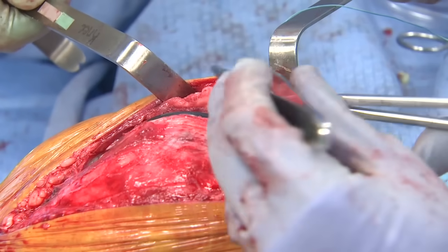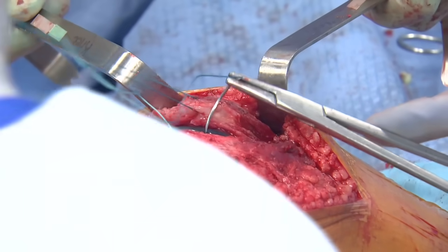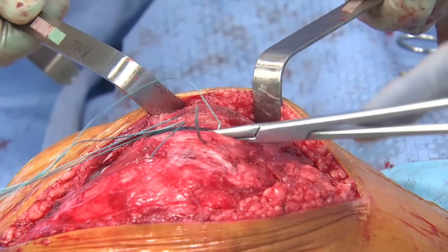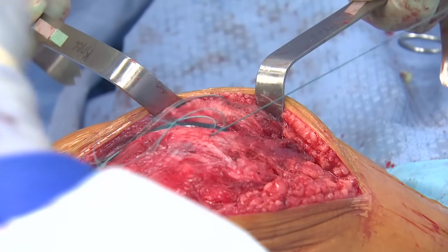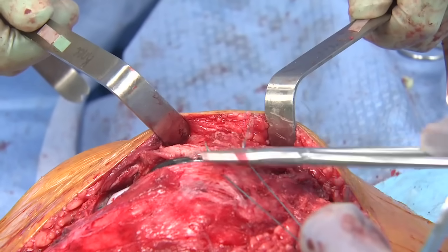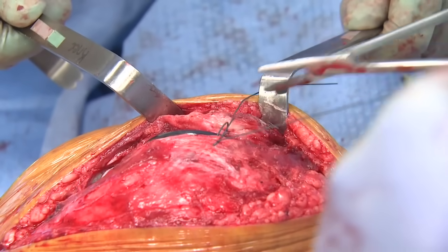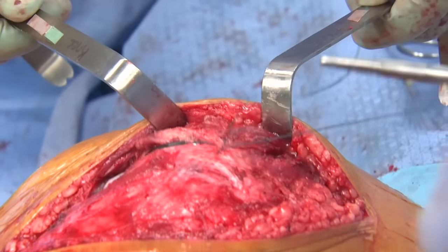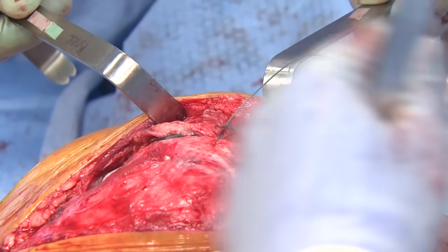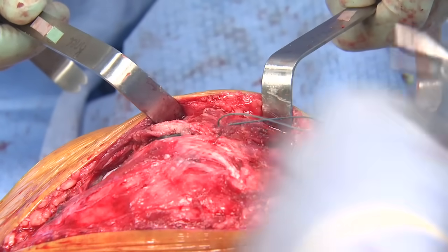Deep capsular tissues are then repaired. Following deep tissue closure, further subcutaneous and superficial closures are carried out by surgeon preference.